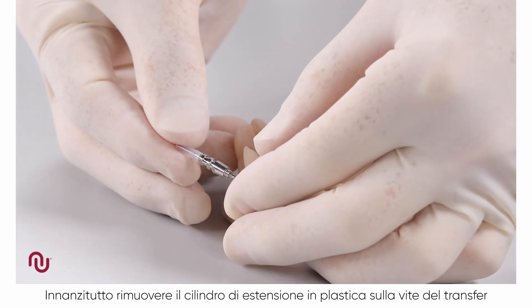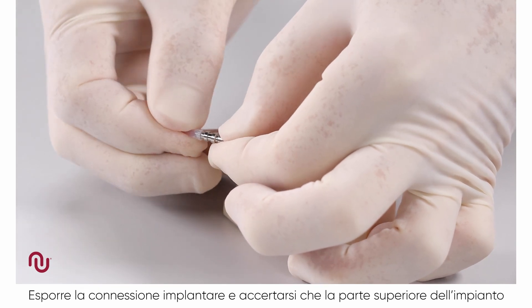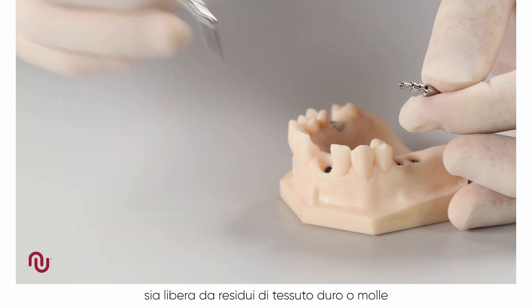First, the plastic extension sleeve on the impression coping screw is removed. The implant connection is exposed and we make sure that the top of the implant is clear of any soft or hard tissue.